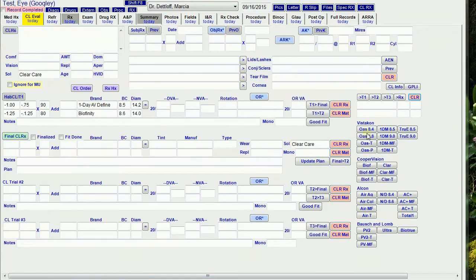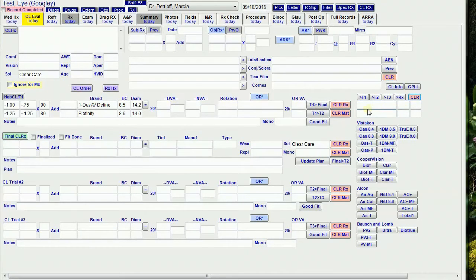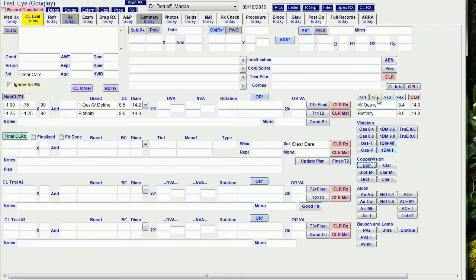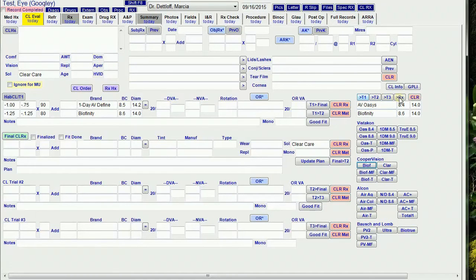I also set up buttons that enter the brand, base curve, and diameter for common lenses into these temporary fields. When I click on the button, if the right eye fields are empty, it goes in there. If not, it goes to the left eye. Then I use the T1, T2, T3, or RX buttons to send it to the corresponding RX fields.